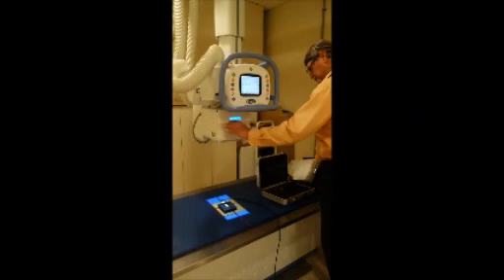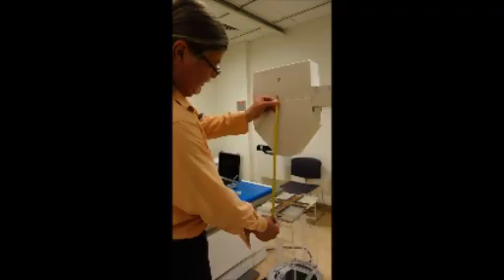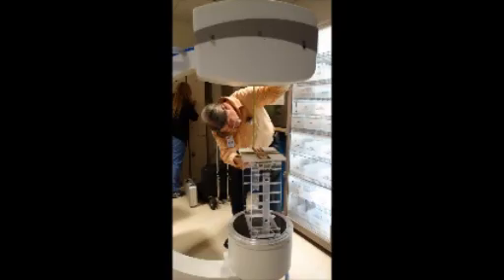The only equipment needed to test reproducibility is an exposure monitoring instrument and a calculator. To perform the test, position the exposure monitoring instrument's probe near the center of the X-ray beam and at an appropriate distance from the tube. An appropriate distance would be where the patient would be located. Either midline or skin entrance would work as long as the distance remains the same throughout the test series.